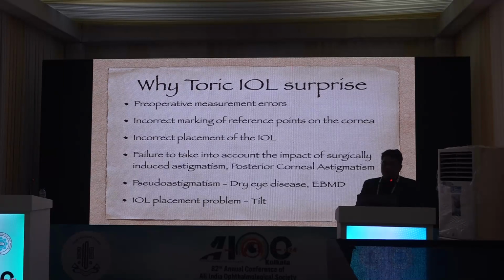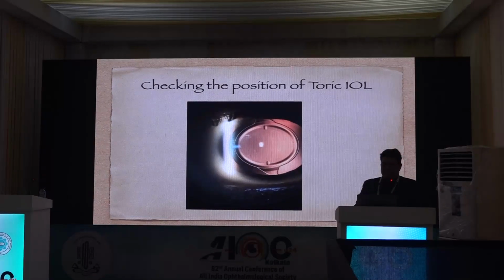And if you have not placed the IOL correctly, suppose by mistake you have done wrong calculations and you have placed the IOL in the wrong axis, or you have failed to take into account the effect of posterior corneal astigmatism or your SIA, or there may be a problem in the IOL placement, because of which, due to tilt, there may be surprises.